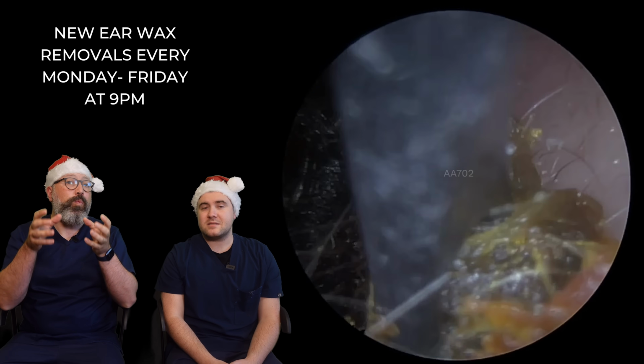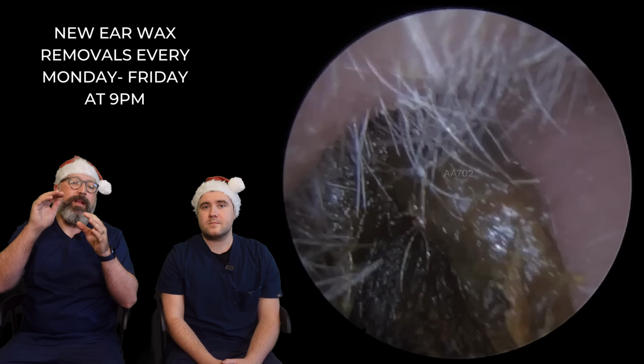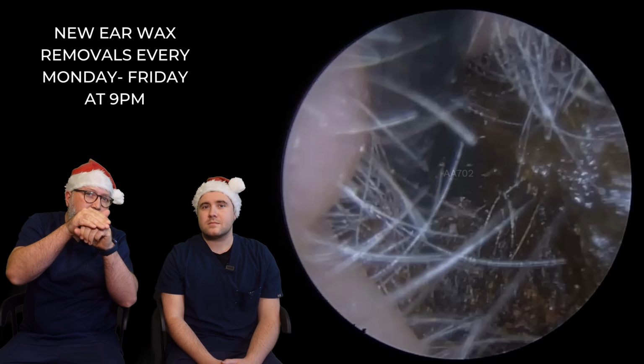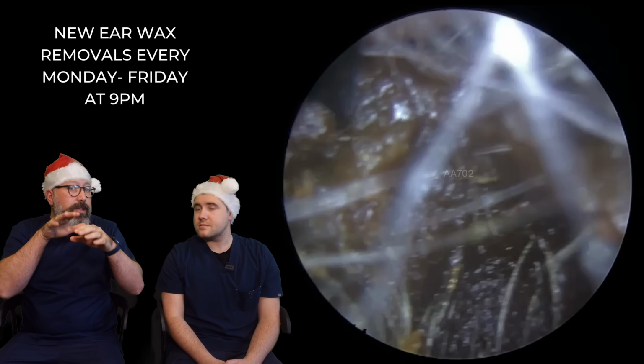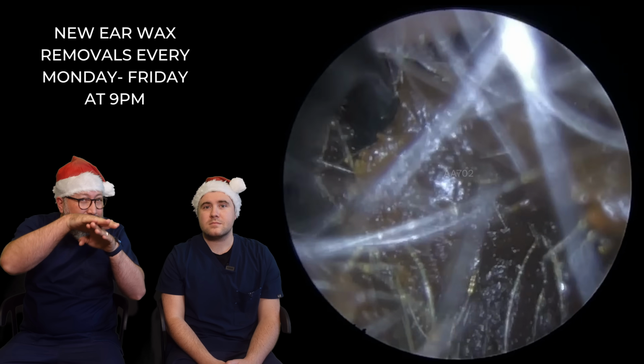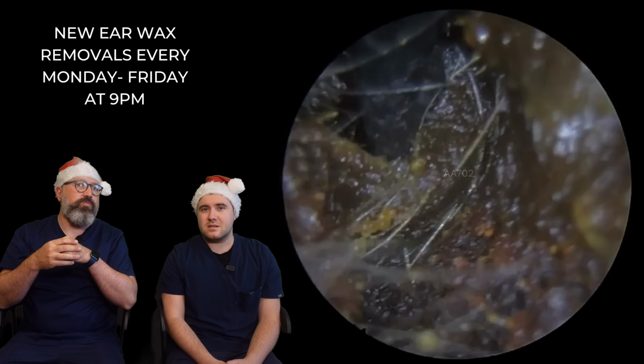And sometimes I will wedge it on purpose in that outer part of the ear canal, because if it's just a little bit too mobile, as you go to scooch over the top of it a little bit, it'll roll that wax further in. So if you wedge it, you can just work your way behind it and squash it down enough to get the Jobson horn a little bit further. But this is really putting up a fight.